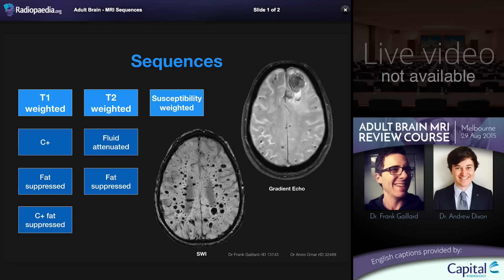Susceptibility weighted sequences represent a number of different sequences that share the propensity to have signal loss due to paramagnetic or diamagnetic effects, so calcium or blood product will result in dark or black signal. The newer sequences such as SWI — susceptibility weighted imaging — are exquisitely sensitive to very small amounts of such materials. In this example of a patient with familial autosomal dominant multiple cavernoma syndrome we can see numerous large black areas. On T1 or T2 weighted sequences these abnormalities would be much smaller — a phenomenon called blooming, where the signal loss extends beyond the anatomical confines of the lesion due to paramagnetic or diamagnetic materials distorting the local magnetic field beyond their margins.